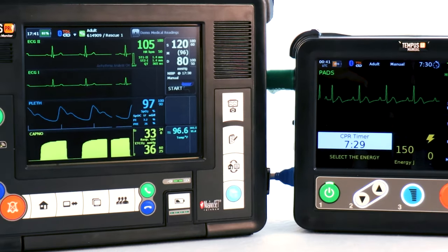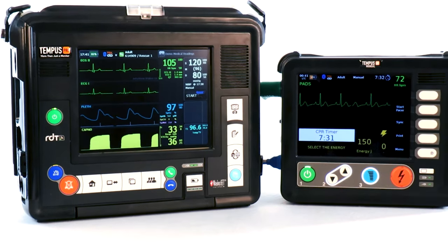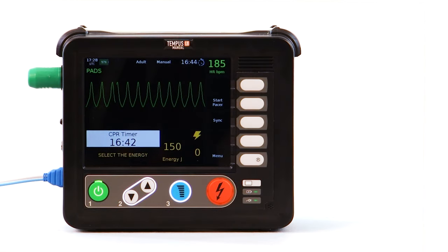The Tempest LS works together with the Tempest Pro and Telespace Quorsium to create a powerful, easy-to-use, trustworthy, and data-driven solution that lets you focus on the patient.